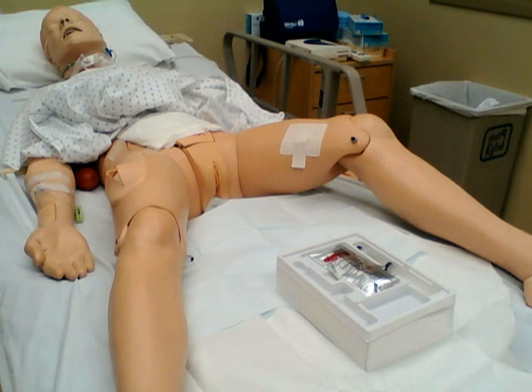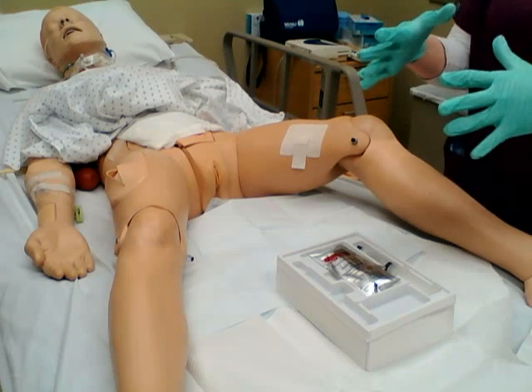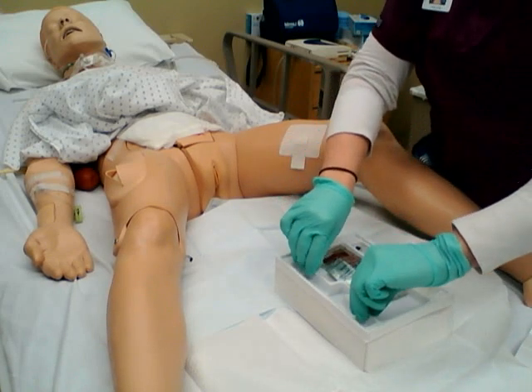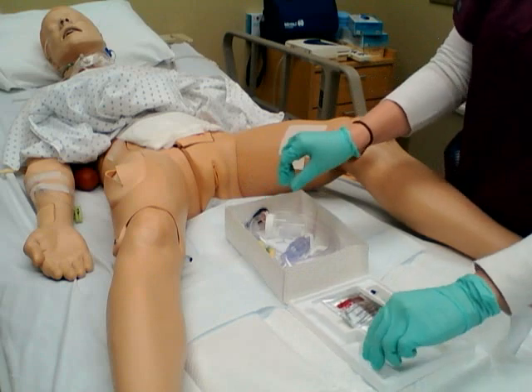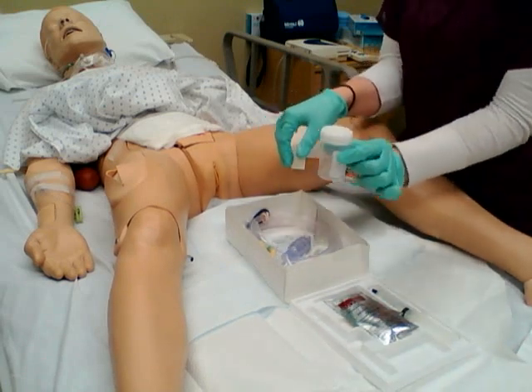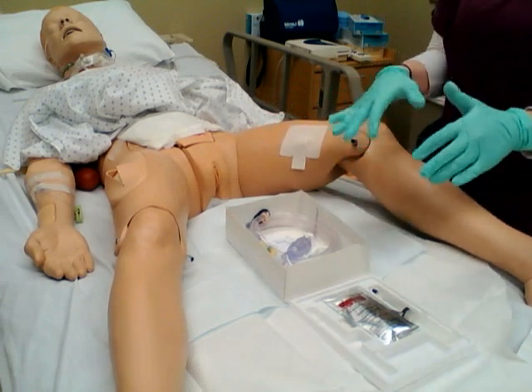In my pack here, I've got my iodine sticks so I can cleanse the patient, and also my water to prep the balloon, and my lubricant for the end of the catheter. So once I've got my sterile gloves on here, so now that I have completely sterile gloves, I'm going to take my pack and separate it. Take this, set it off to the side. That's for a specimen later.